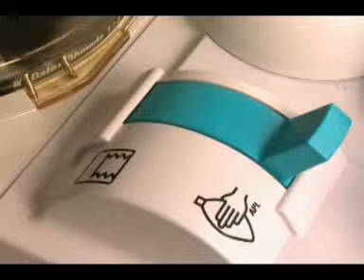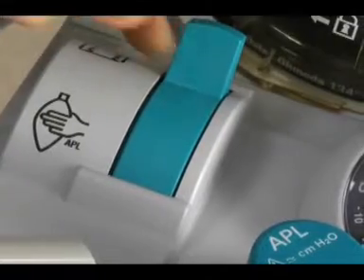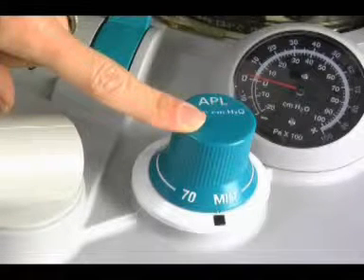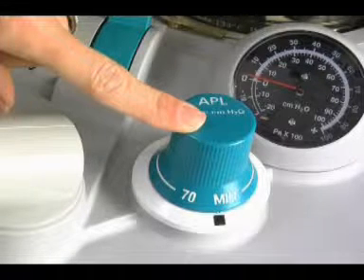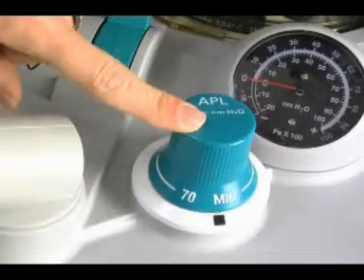The APL valve, or adjustable pressure limit, releases gases to atmosphere or to the scavenging system, and its purpose is to provide control of the pressure in the breathing system. A clockwise motion increases the pressure, and finally it will close the valve. The APL valve is part of the flow path when it is in the bag mode.